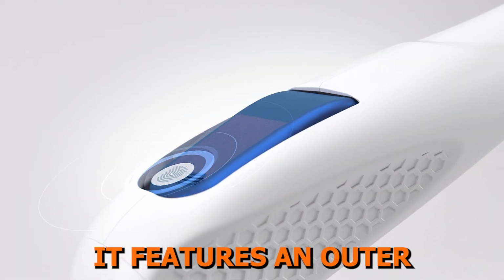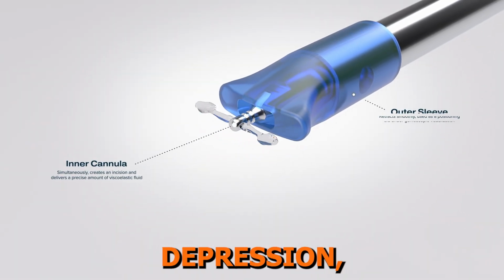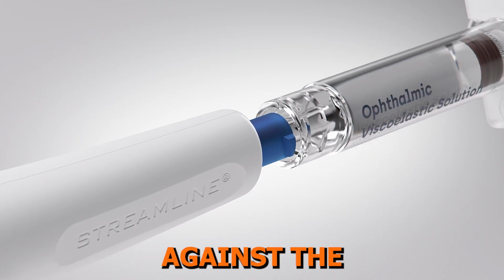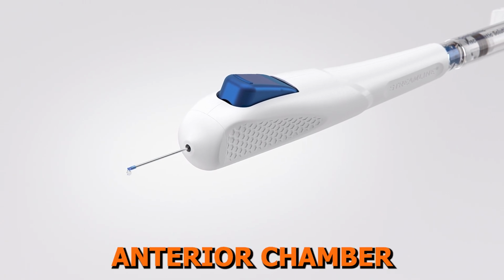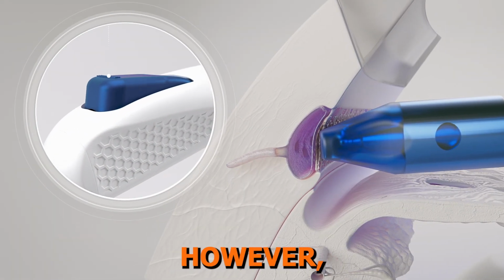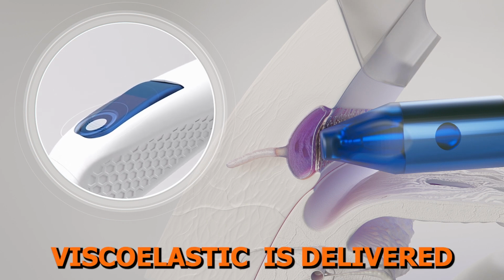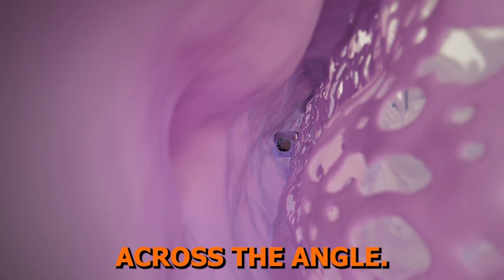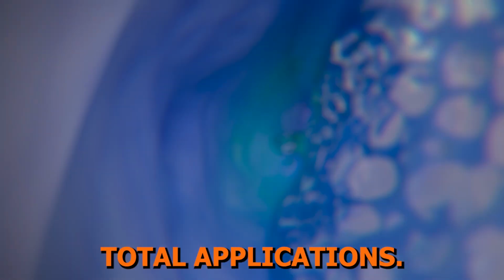It features an outer sleeve that retracts with button depression and serves as a guide to position the tip of the dispensing inner cannula against the desired area within the anterior chamber. The inner cannula is fixed and does not move forward during the procedure. However, as one depresses the button, viscoelastic is delivered into Schlemm's canal. This can be performed multiple times across the angle, up to 8 total applications.